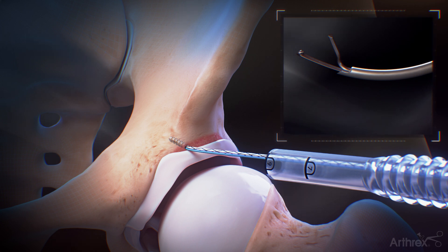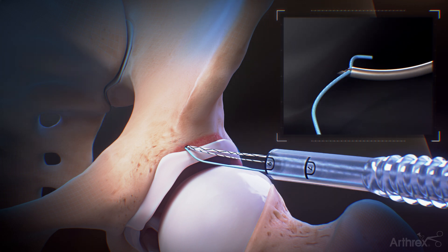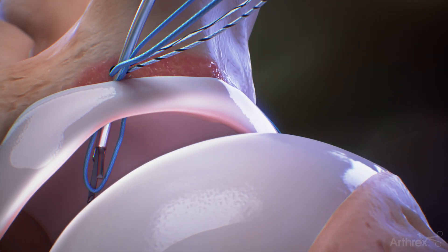Load approximately 10 mm of the repair suture into the jaws of the swift stitch suture passer. Use the swift stitch to pass the suture through the base of the labrum and release it into the joint space.